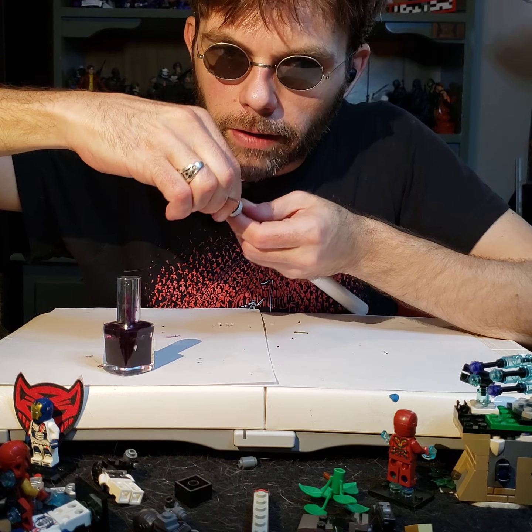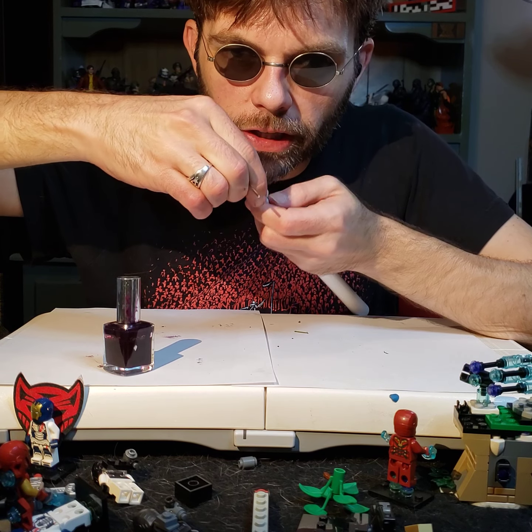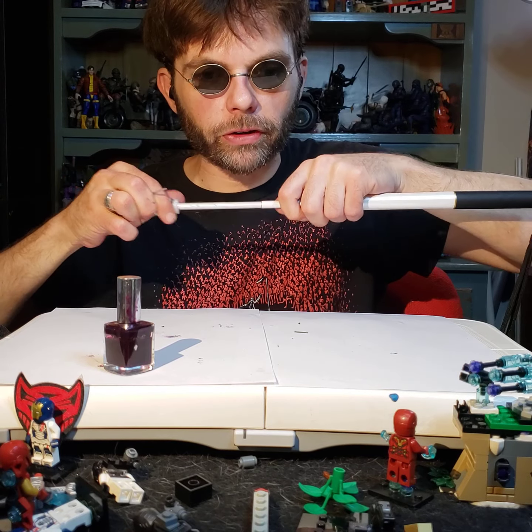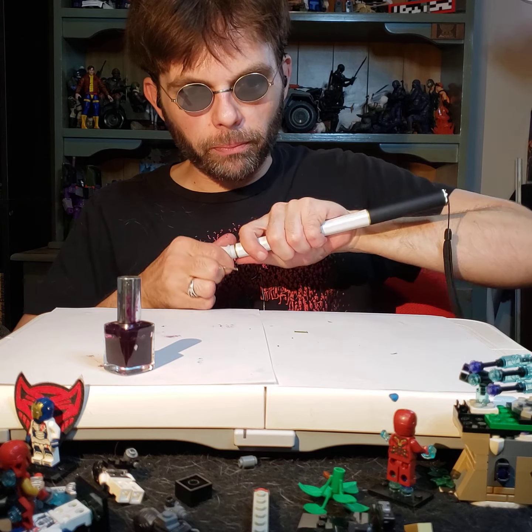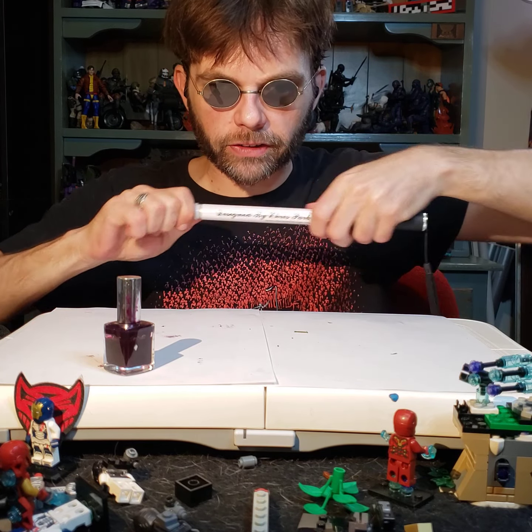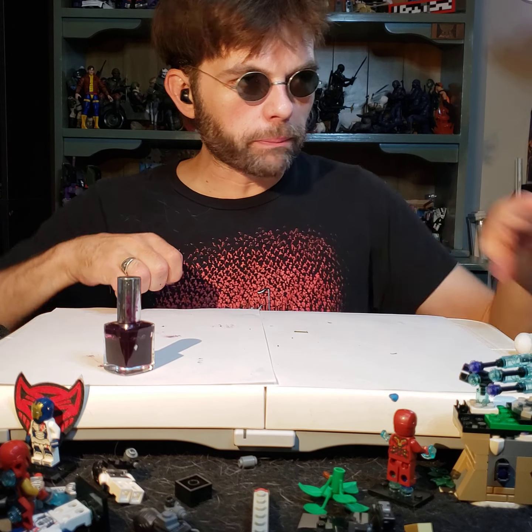There we go. Give it a yank just to prove to yourself that it's not going to fall off while you're walking in the middle of the street. Yep, I don't think this guy's going to fall apart while I'm walking in the middle of the street. Sweet. I have now helped myself out and helped Good Samaritans out so they don't have to put themselves in danger to assist me. And that is being a responsible blind person right there.